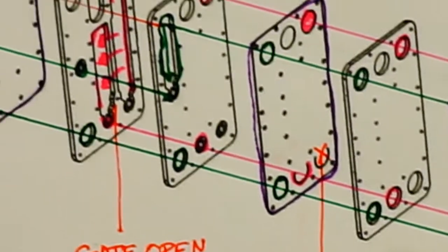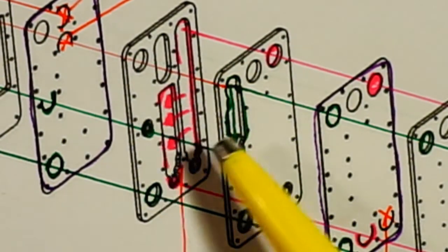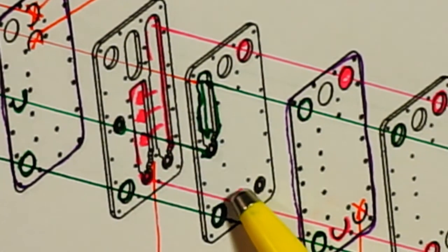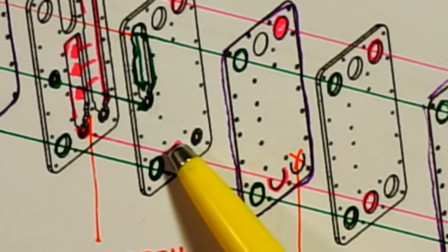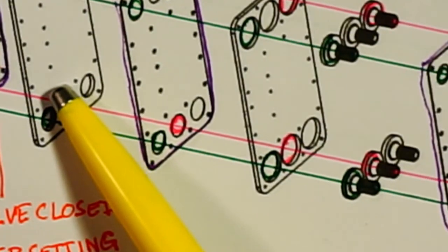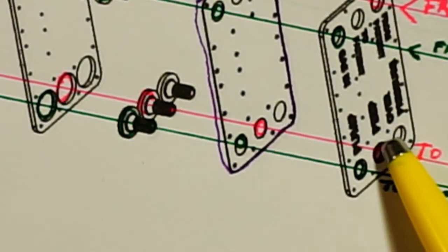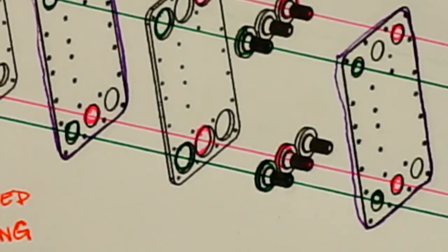So let's take a look at that. So air can flow through here. Then down at the bottom of this chamber, we have the check valve leading to the PEEP system. That's this flap. And again, there's some support in this hole so that the flap can't be sucked into this hole, but it's being blown out this way through an exposed hole. And then the flow exits through this PEEP port right here to the PEEP. Okay.